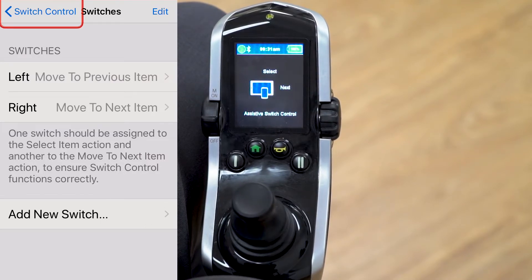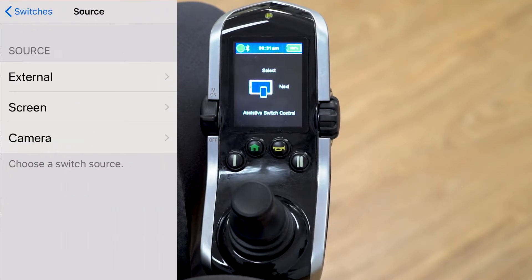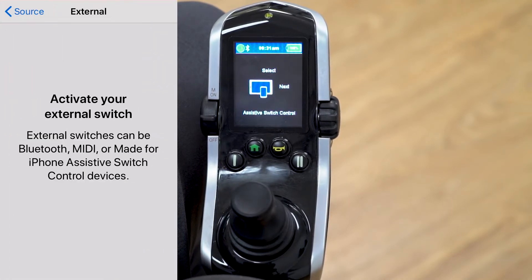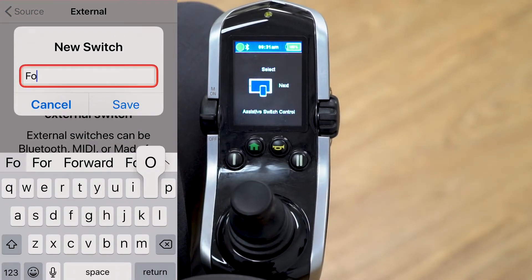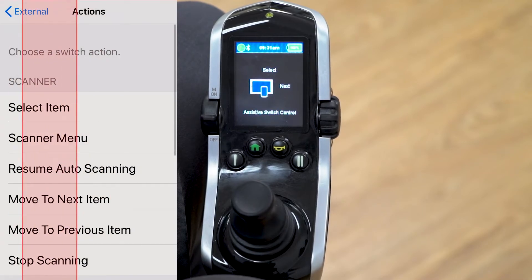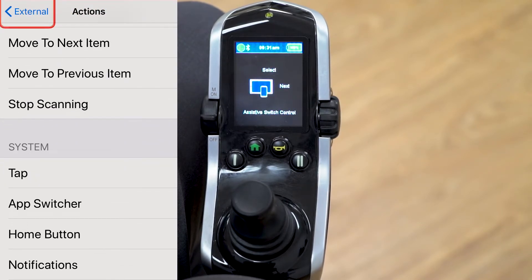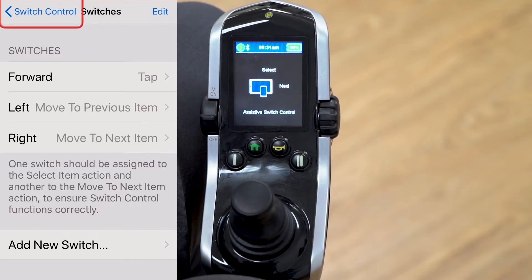That one is saved into the iPhone. Click add a new switch, choose external, give a forward command on the joystick, name it 'forward,' and save it. Assign this one as tap — just like tapping the touch screen on your iPhone.